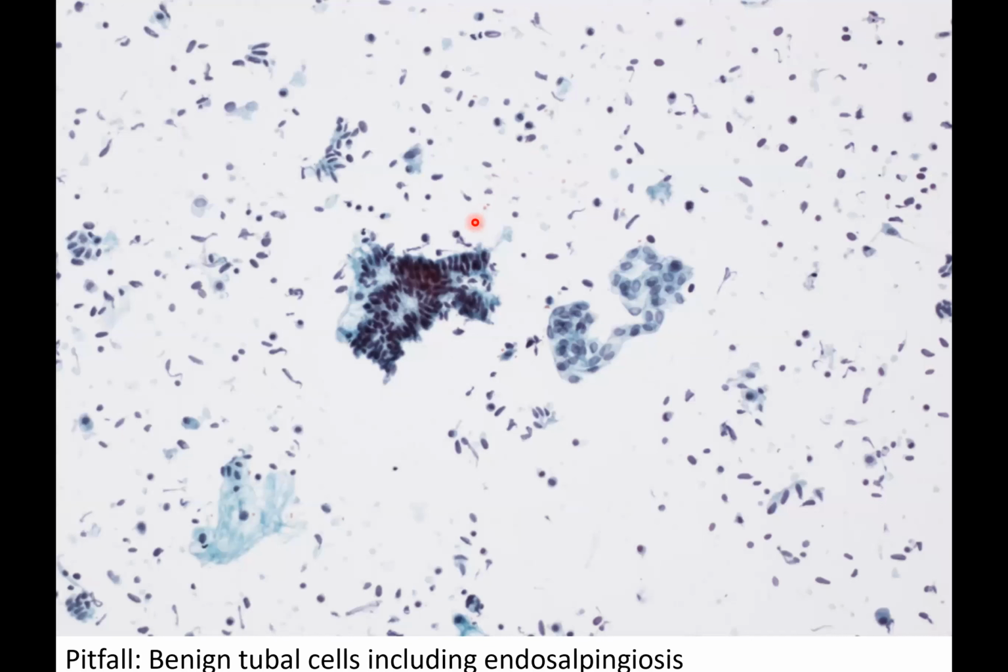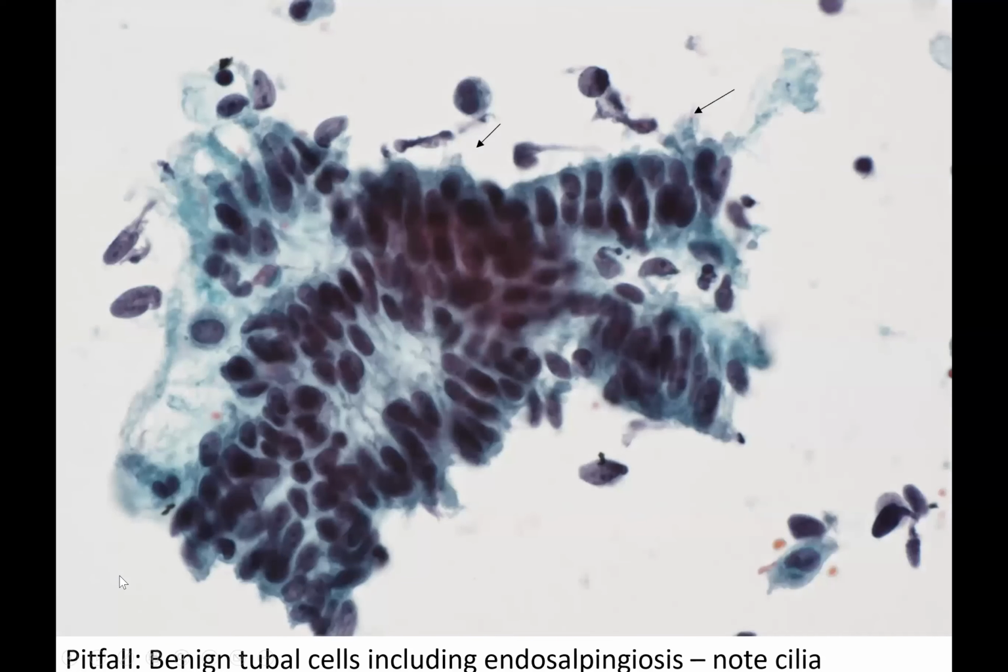This is a washing taken during laparoscopic removal for a benign serous cystadenoma, but interestingly, histologically, it was described as having a defect where the fallopian tube was attached. The group itself looks a little bit worrying, quite hyperchromatic. However, at higher power, you can see that these cells are ciliated, and therefore, given the clinical scenario, we concluded that these were benign tubal cells and that the washings are negative and not AUS.